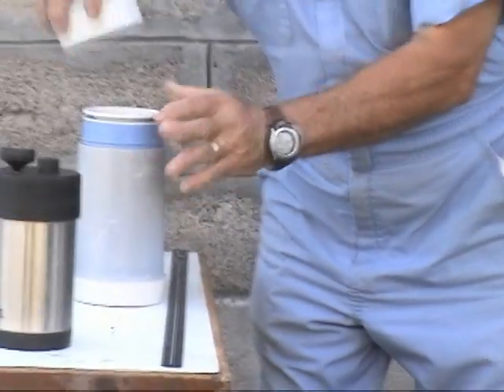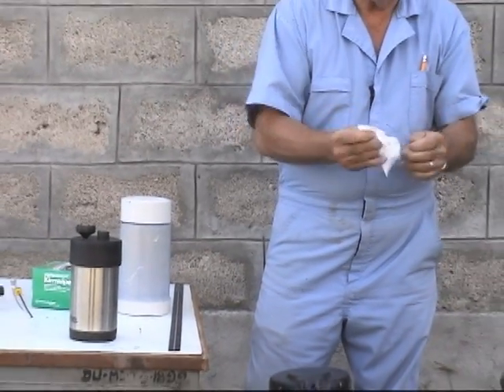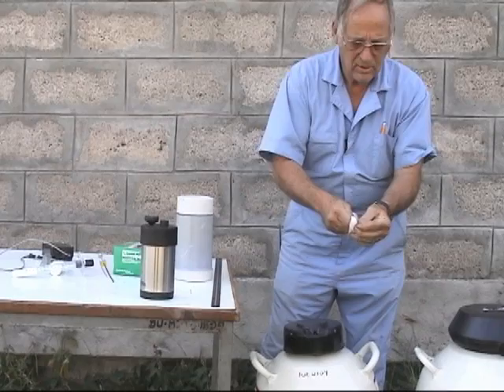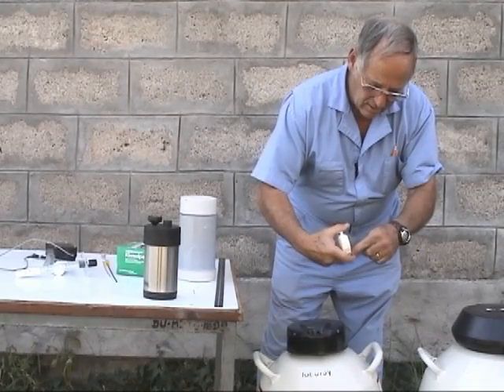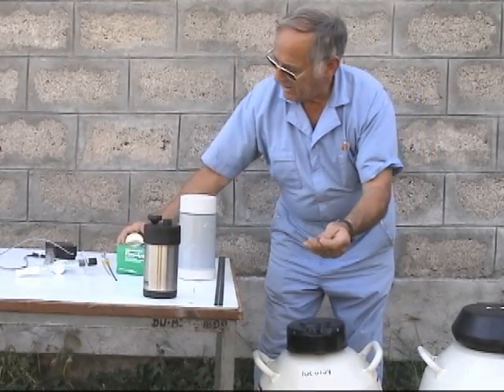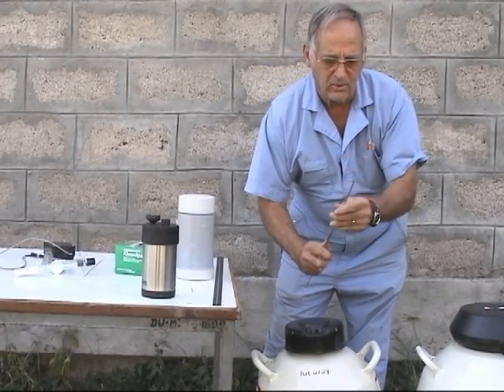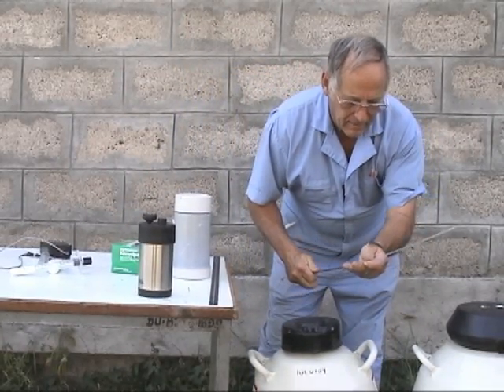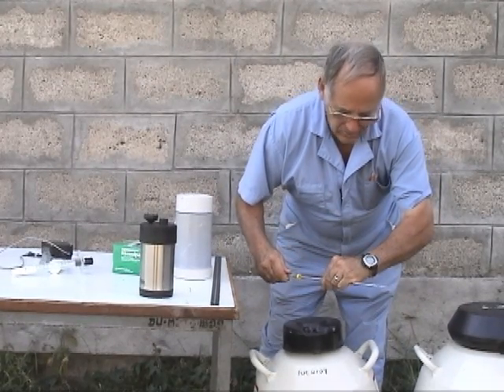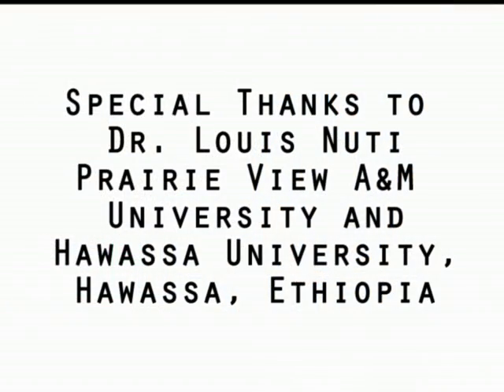Now the semen is thawed, we remove it, dry off all the moisture from the outside of the straw, cut off the plug end, and then we are ready to load our AI gun. We put the sheath around it, lock it on, and we are ready to use the gun for the insemination.